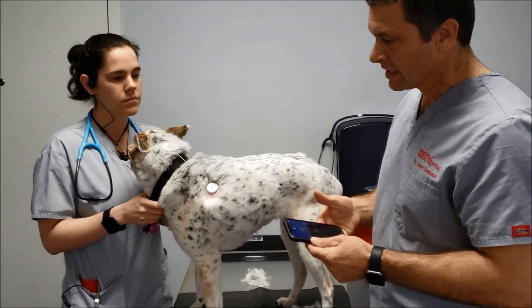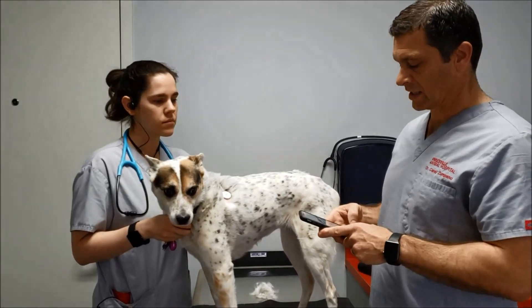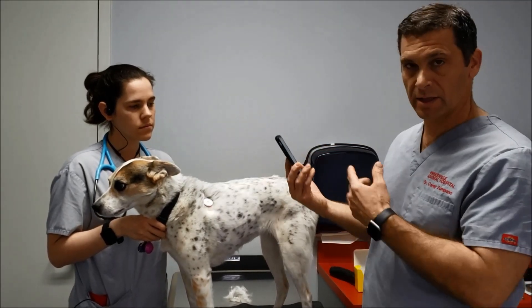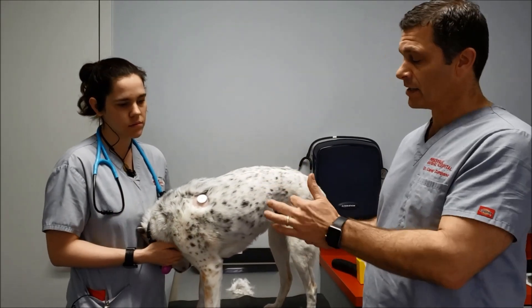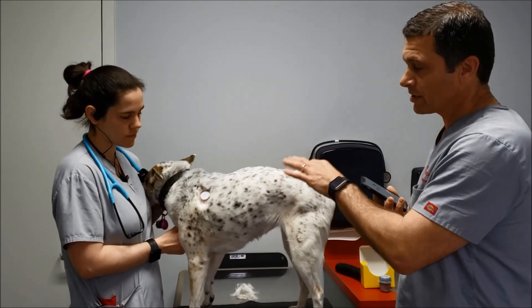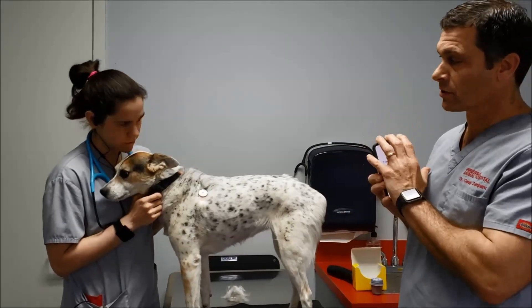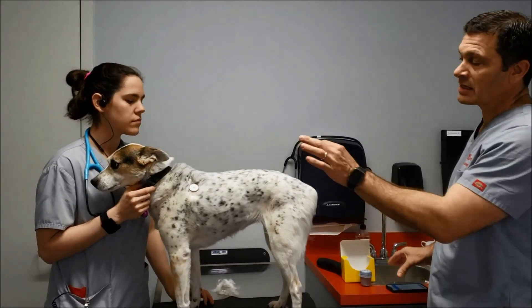Once it's applied, it takes about eight hours to start functioning, so you just initially get it started. Once it's running, you hold the phone up to it — just like Apple Pay — and it makes a little beep. The app will tell you what the actual blood sugar is currently, and it will also download the last eight hours of blood sugar readings. Owners need to make sure they do a download every eight hours, since it doesn't store data longer than that. Then that data is stored on your phone, and you keep tracking it for two weeks.